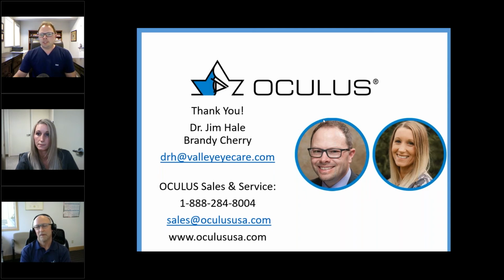Well, the fourth thing I put on there is just kind of next level stuff. For so many of us that are blessed to have these amazing technicians, taking it to the next level is empowering them to help you be more efficient. And that requires giving up a little bit of decision making to them. So when you walk into the room, if you've trained your technicians to just glance at a visual field and know what a midline defect looks like, or so many other things that they can learn easily, if they're prepared to alert you, if you're open to listening to them, that's the next level, because that by itself can save a ton of time and facilitate on-demand perimetry amongst other benefits. That's fantastic.